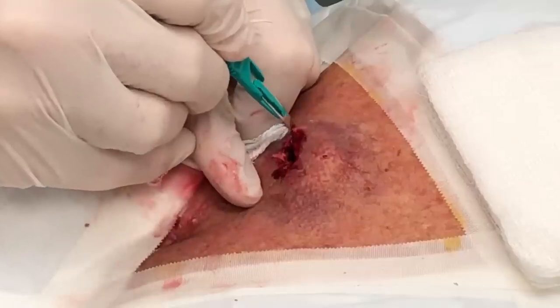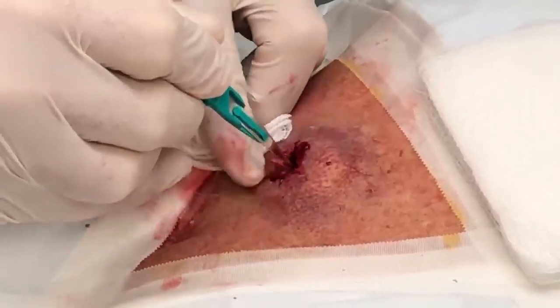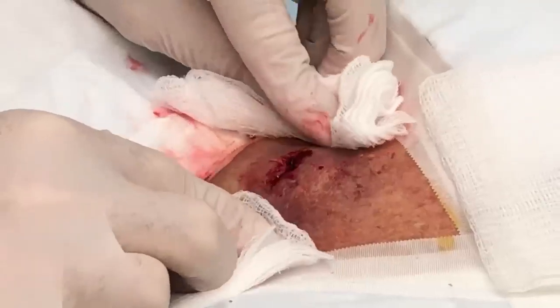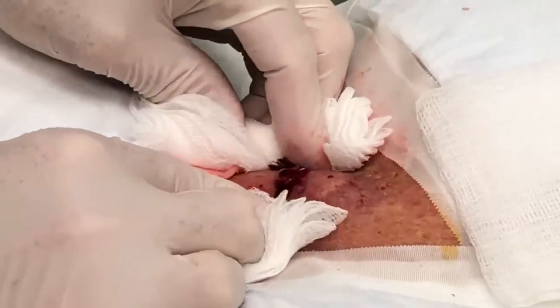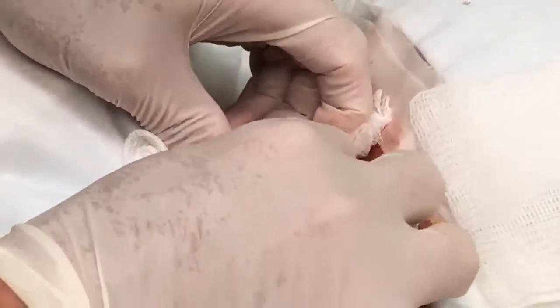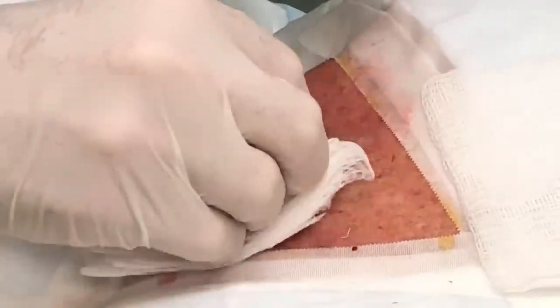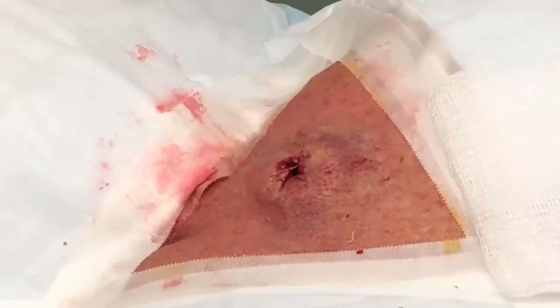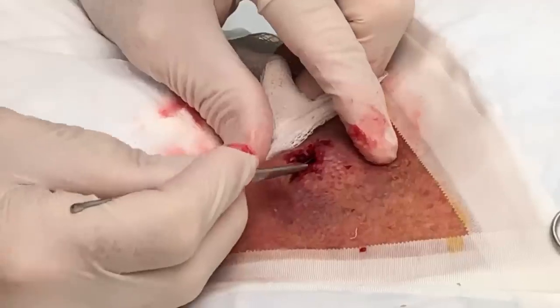So for students and so forth that find themselves in this situation, you want to do your best to empty the sac or empty the cyst as much as possible. You want to make the patient comfortable. You want to get them on some antibiotics, and you want to do your best to clean it out as much as possible. Get as much of the oily, proteinaceous material out of this that you possibly can. If you're able to, get a curette and get in there and start scraping.